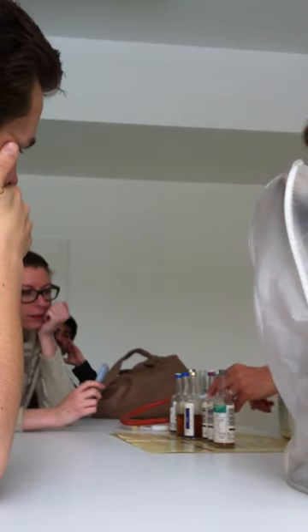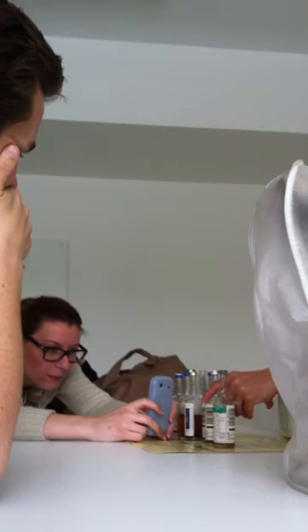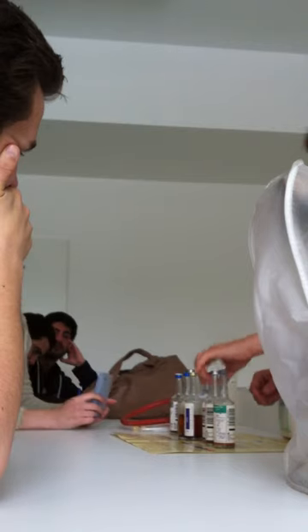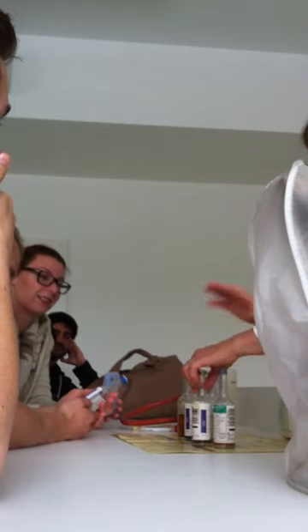Not so important, but if you see pediatric, there is a pediatric bottle for children because the blood amount is less, 1 or 2 milliliters. It is the pink color. The babies, the girls prefer the pink color, but it's not associated, I just try to have it.